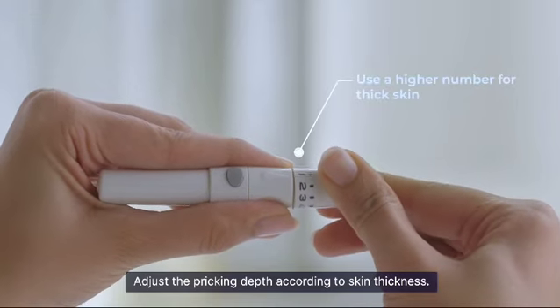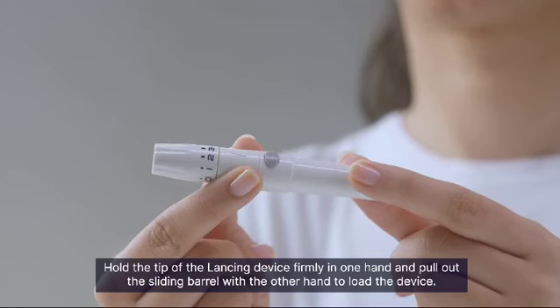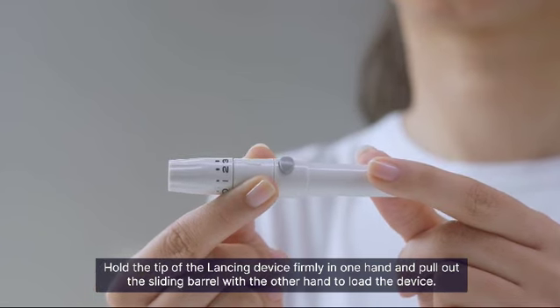Adjust the pricking depth according to skin thickness. Hold the tip of the lancing device firmly in one hand and pull out the sliding barrel with the other hand to load the device.